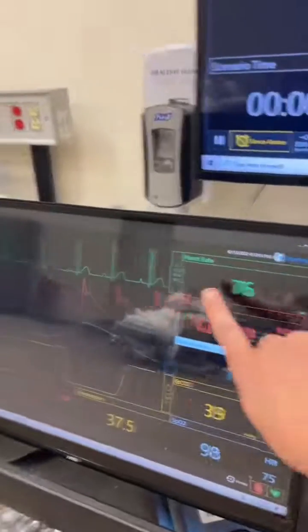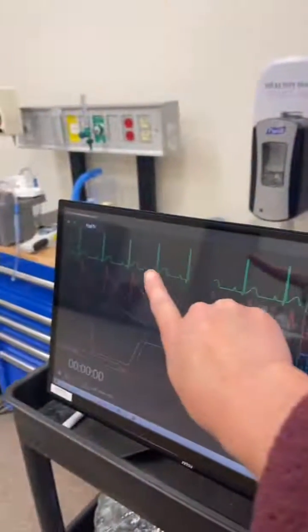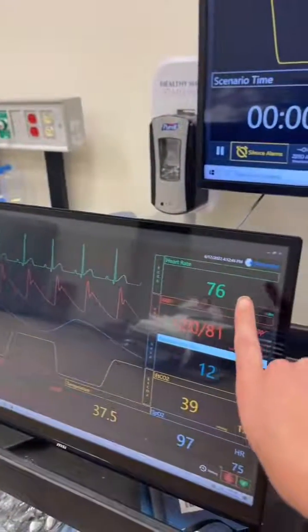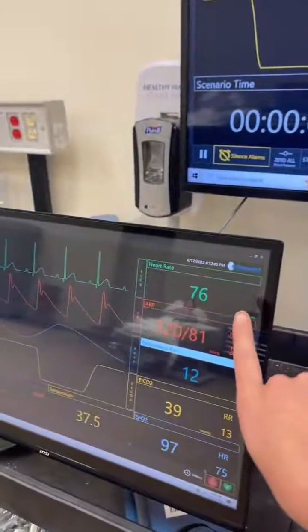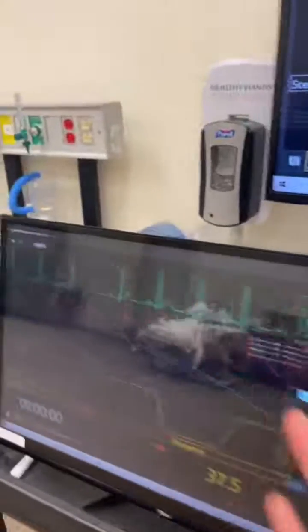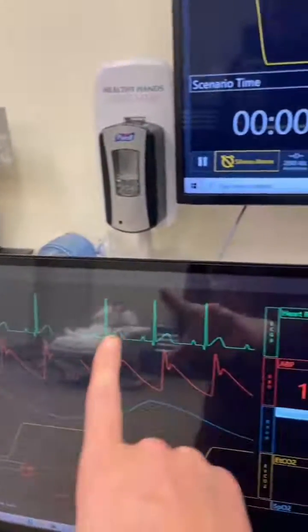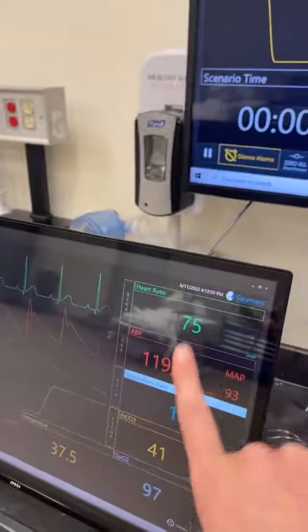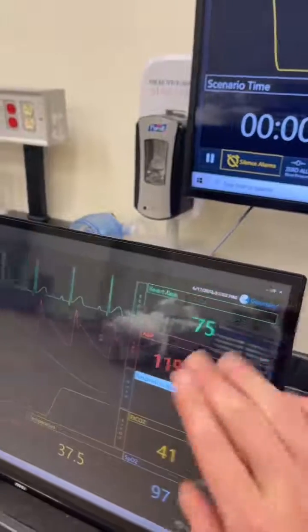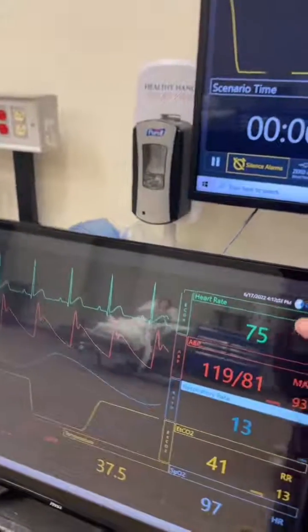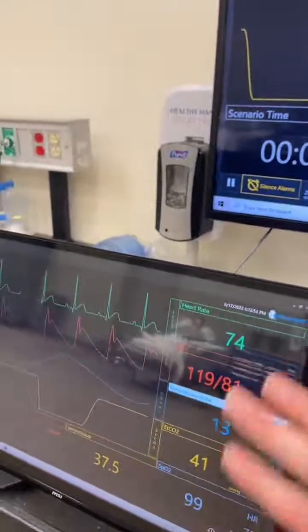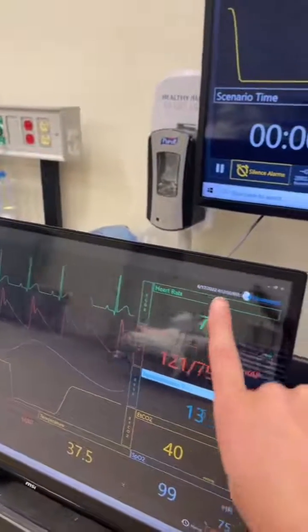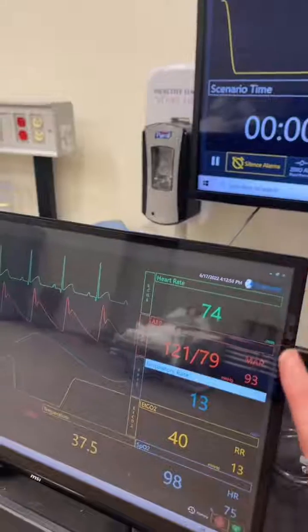At the top in green, that is their five-lead continuous cardiac monitoring. This is a beautiful, perfect normal sinus rhythm with a heart rate of 74. So that's what that top number is — it's almost always defaulted to be at the top and in green.